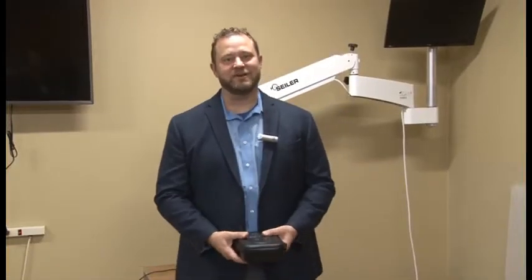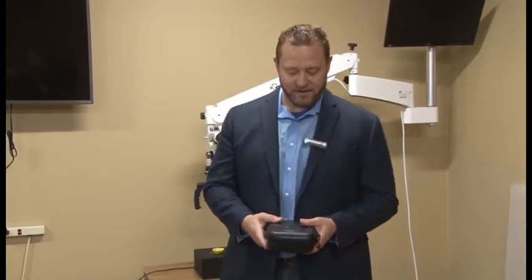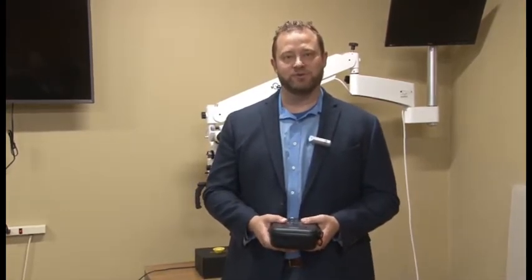Hi, Dane Carlson, Division Manager at Seiler Medical. Today what I want to go through is how to put the GoPro on correctly on our microscope, then go through a couple of the functions that you need to be able to display it onto the monitor.